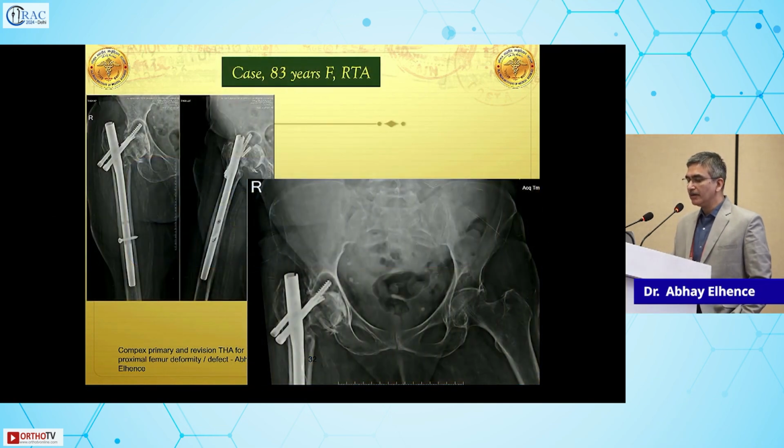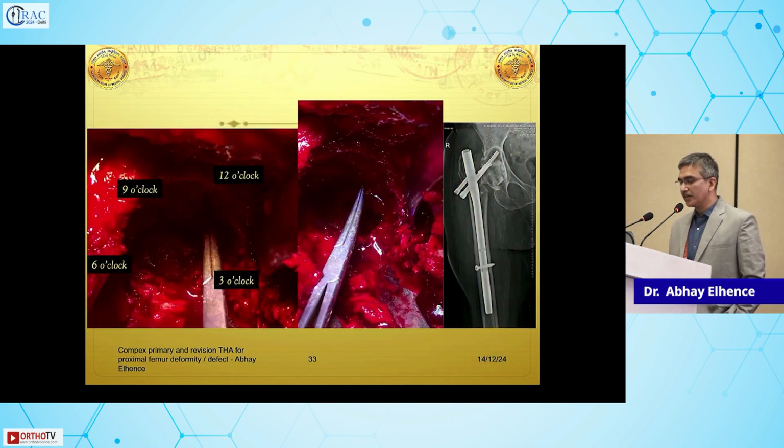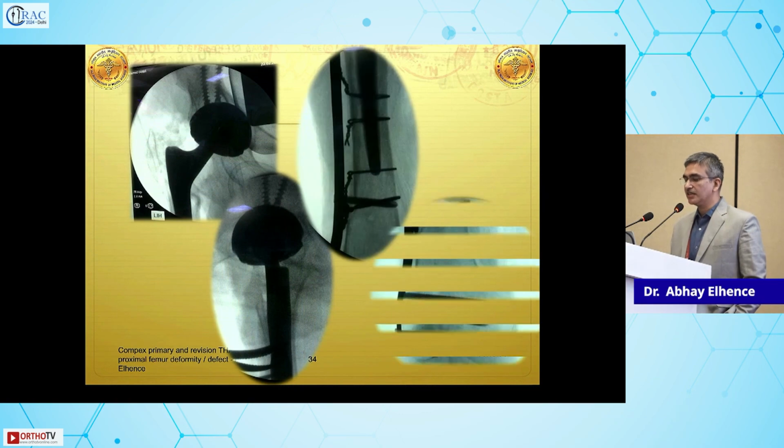Trochanteric malunions, again. What we see here is the acetabular defect. What we see here is the acetabulum which has gone wrong, the neck which has gone avascular. But what we don't see here is the GT which is not united, which will cause an abductor dysfunction, which has caused a proximal femur problem. Again, if you use a metaphyseal fixing stem with a standard cup, you might land up not restoring your biomechanics, your horizontal and vertical offset, correctly, and thereby getting a hip instability which you don't want. So it is very important to factor in what you will do, the defect understanding, the defect reconstruction.